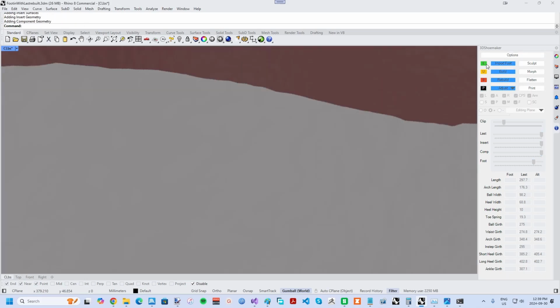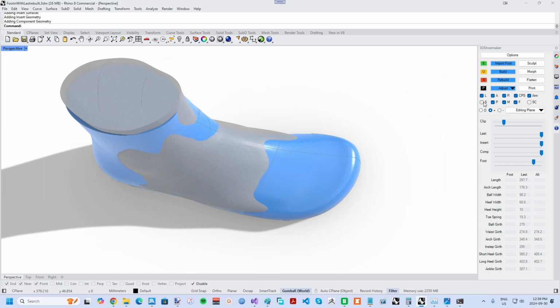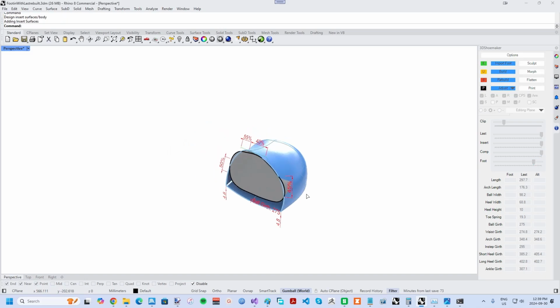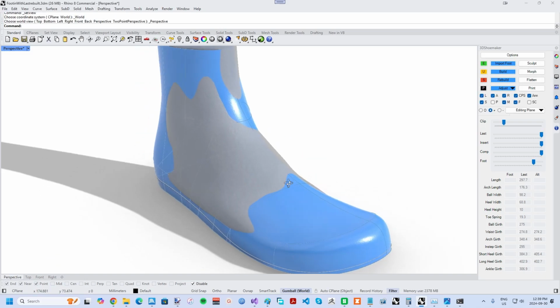The advantage of this approach is that the foundation of footwear design becomes more scientific, leading to better repeatability and thus opportunity for improved comfort in the resulting footwear. Yet, the parametric approach is not suitable in all situations.